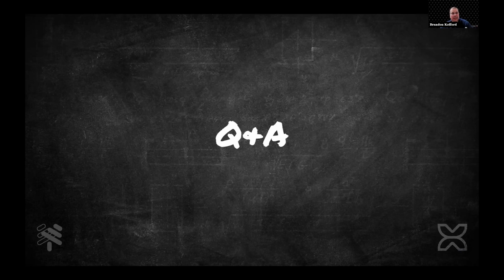So I think what you're asking, and whoever asked that question, it's a great question. Correct me if I'm interpreting it wrong, okay? But I think what you're asking is, I've made an implant level impression, and now my laboratory is selecting my multi-unit abutments and placing them on my master cast and making the prosthesis on that master cast with the multi-unit abutments to the implant analogs.